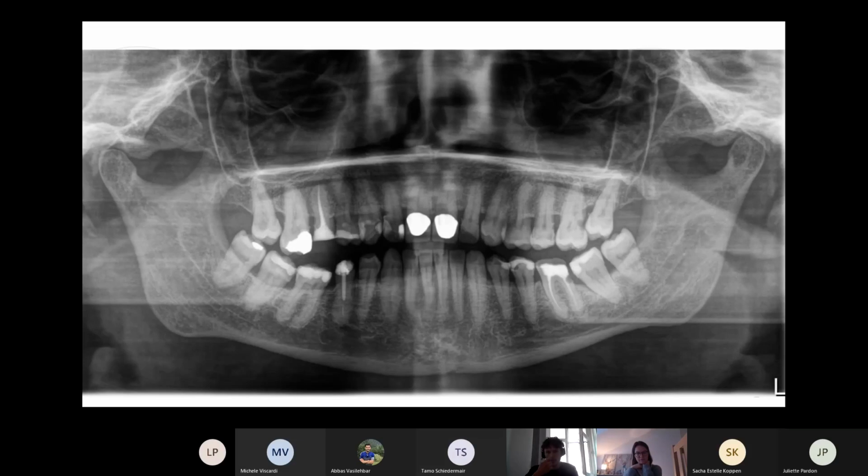Or maybe look clinically in the mouth if it's occlusal caries, for example. Then in the fourth quadrant, like with the incisors, it seems all fine. In the fourth quadrant, the number 5 is root canal treatment and root canal inlay. Here, the endodontic treatment looks a bit poor.